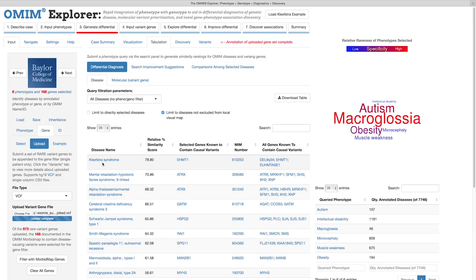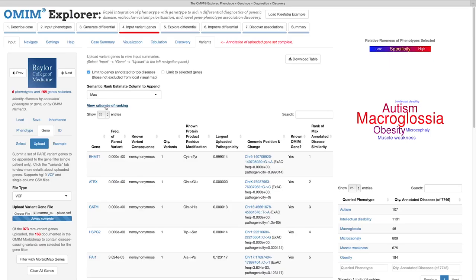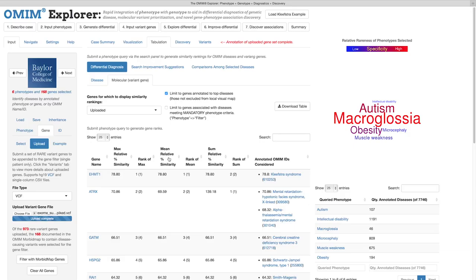Additionally, if we click this Rank Rationale link here, we see an explanatory listing of the causally linked diseases whose match scores were used to come up with this ranking. Note that when I clicked the link, the Workflow Wizard color guide disappeared to indicate that I've deviated from the suggested workflow. This isn't a problem though, as we simply need to click the button for our last step to get back on track.